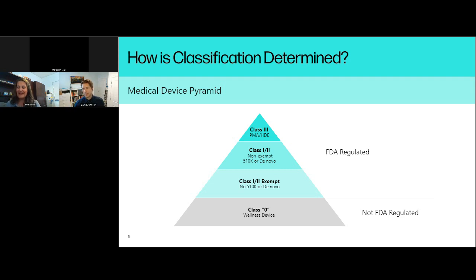I am unaware of any white papers or research that is directly addressing that and that people can say, well, this is what it says, so this is what we're going to follow. And I should mention, in addition to the ASTM standards and the FDA guidance for any specific type of medical device, and again, we're talking orthopedic devices, the FDA also has, and we did talk about this at AMUG, a whole guidance document on if your device is additively manufactured and what you need to make sure you're addressing from quality systems, IQ, OQ, PQ, validations, and continuous testing.